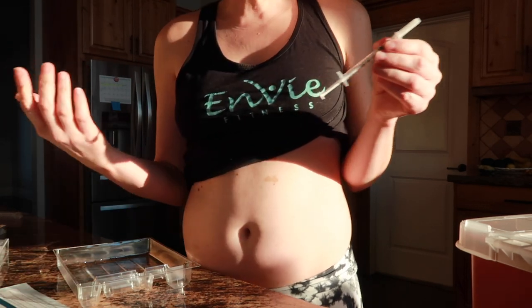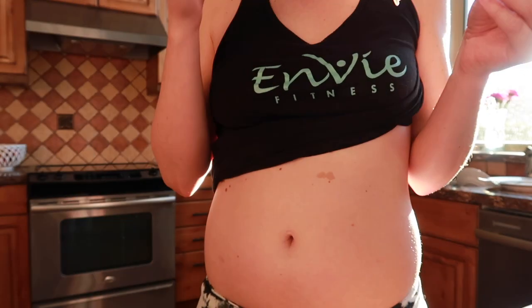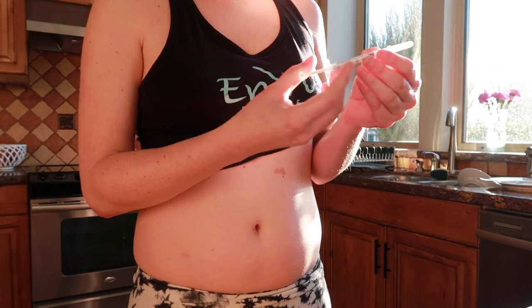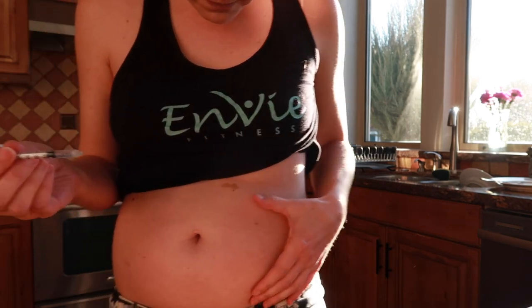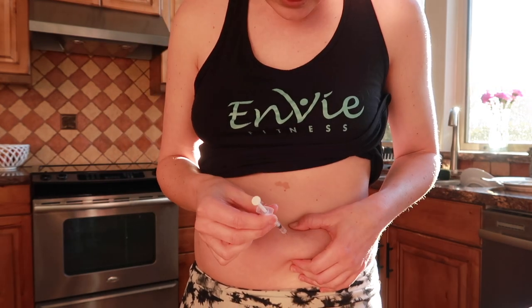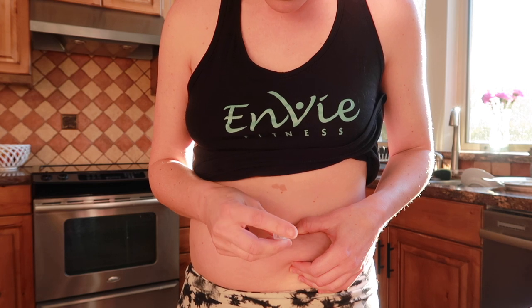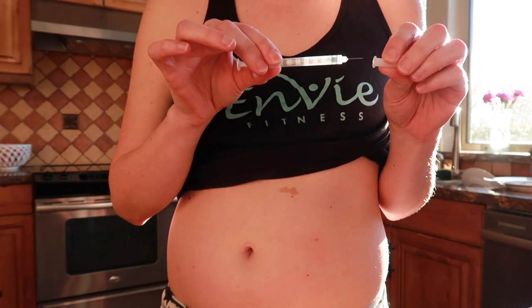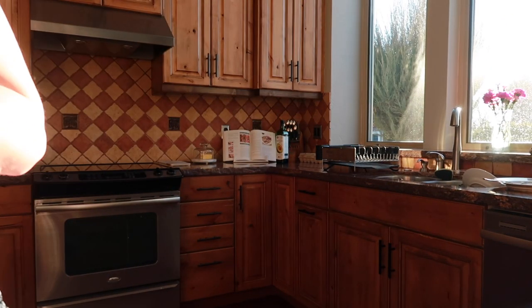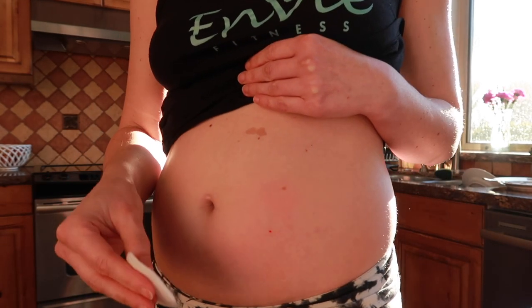Uncap the syringe and inject the prescribed dose — that's all it says to do. I've looked online and some people say you're supposed to hold it in there for like 10 seconds. Okay, are we ready? It's gonna be fine, Jolene — it's not even a big deal. Okay, in. You're supposed to let go of your skin before you pull the needle out. Cap back on and into the sharps container. Just a tiny bit of blood — right there, just a little bit.